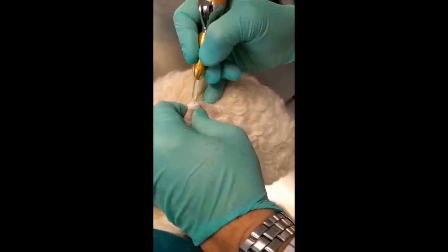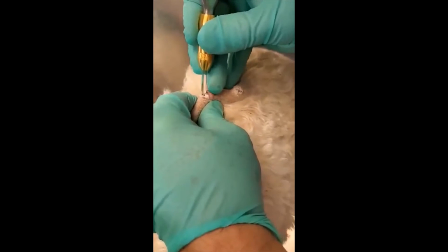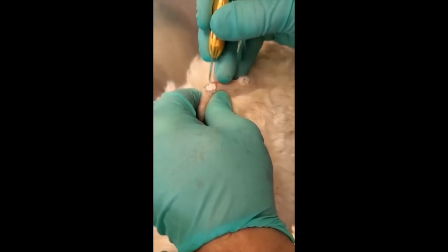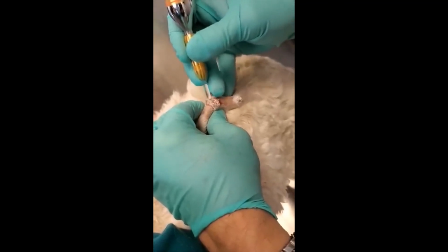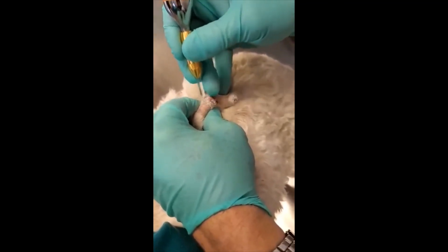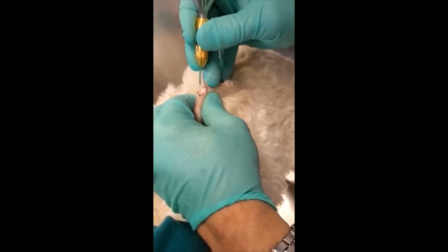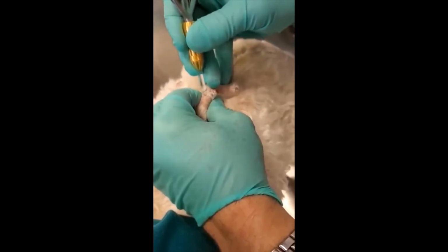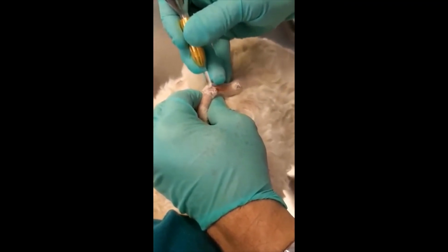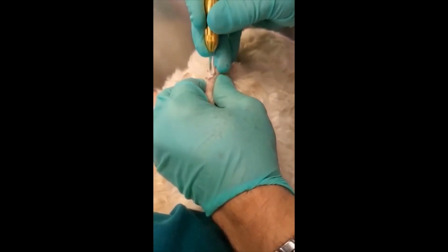30 seconds. Okay. So we have put a little lidocaine subcutaneously on all these masses. This dog is a little bit fractious, as well as the number of lesions present instigated the desire to block these lesions. 5 more seconds. 30 seconds.